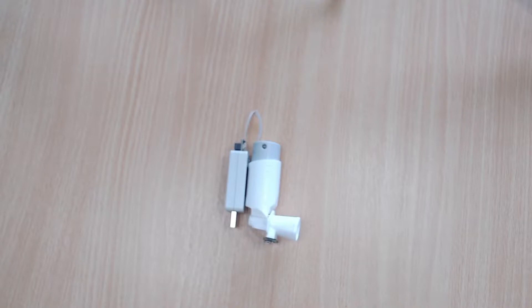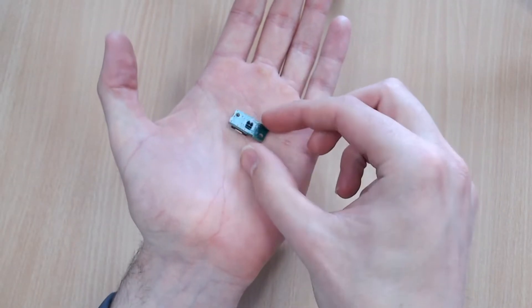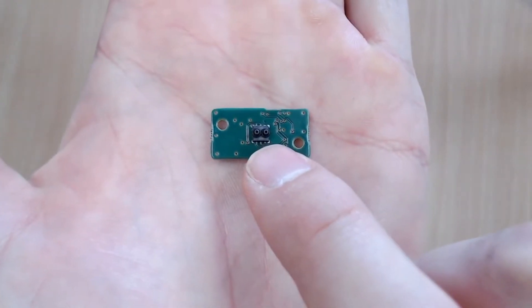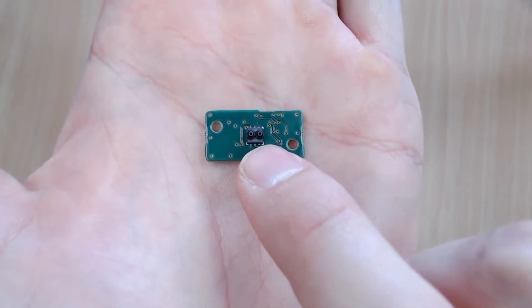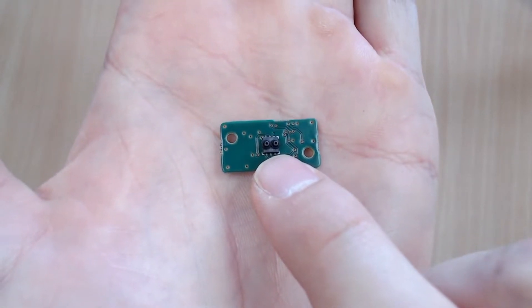Now some of you might not be familiar with the FLS110, so I'm going to hold up an example PCB. The FLS110 is the world's smallest mass flow sensor. You can see it there — it's that small black component in the middle of the green PCB.